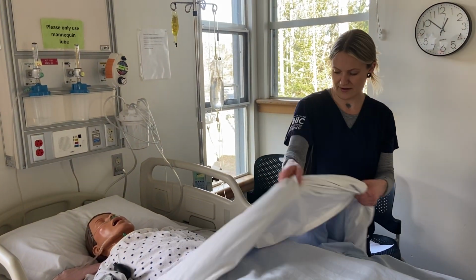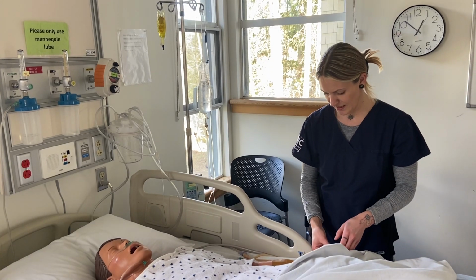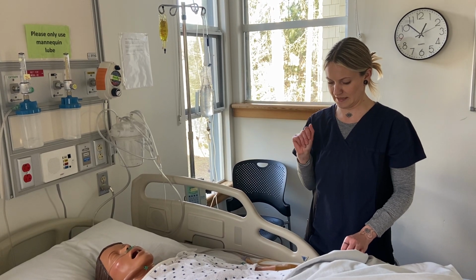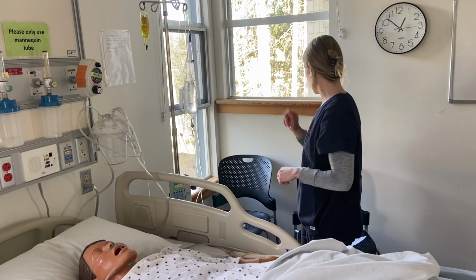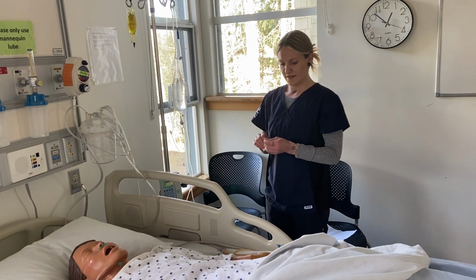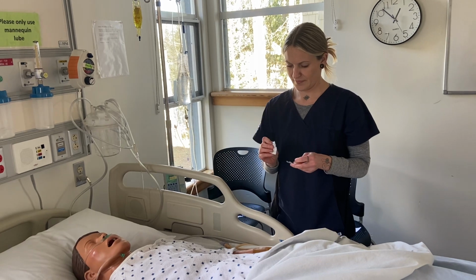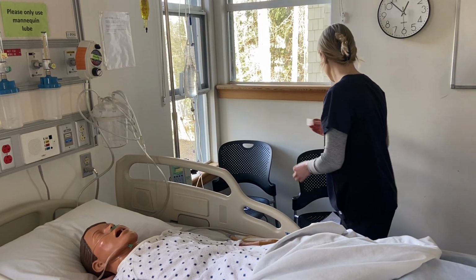So what I will do now is I will just have a look at the IV site just to ensure that there's no swelling or redness or blood anywhere. There's not, so I don't have to use any gloves. All right, so I've hung my medication. Next thing I will do, swab that, and then I'll do a flush.